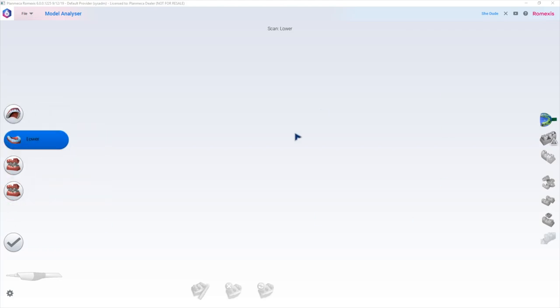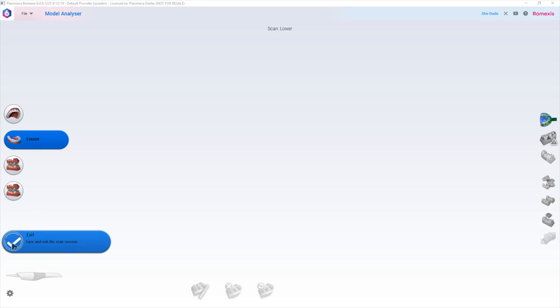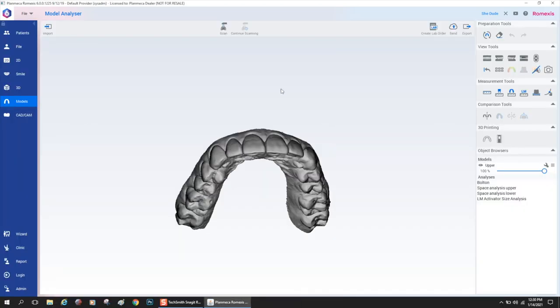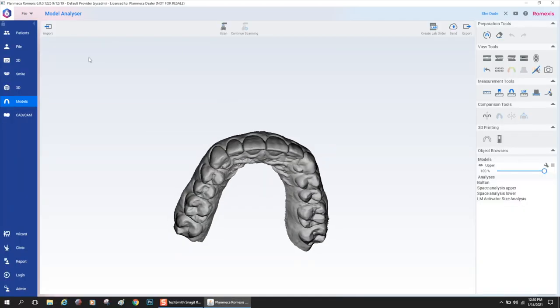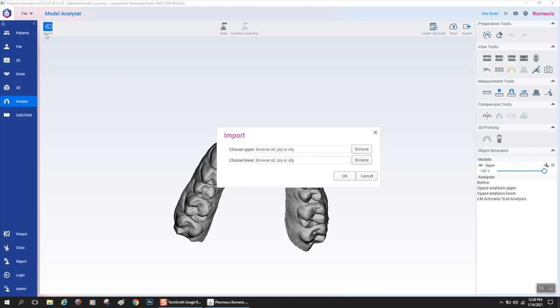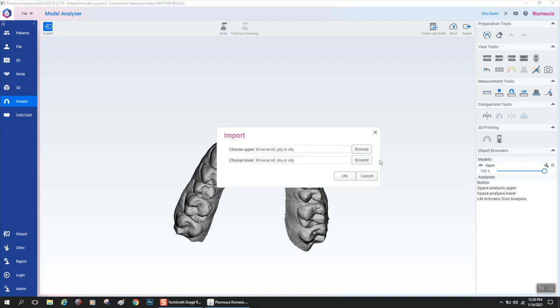You have the upper, lower, and the bites. A lot of orthodontists who have the Emerald S just use this for scanning and they scan right in model analyzer. Once you scan in model analyzer, the data would be instantly available to do your orthodontic work.